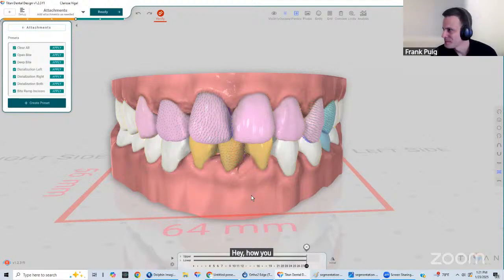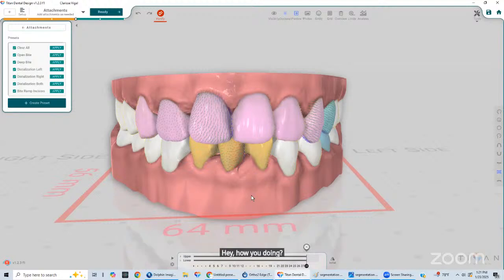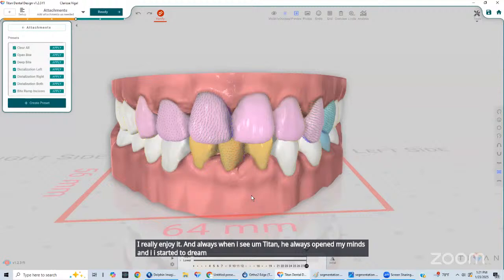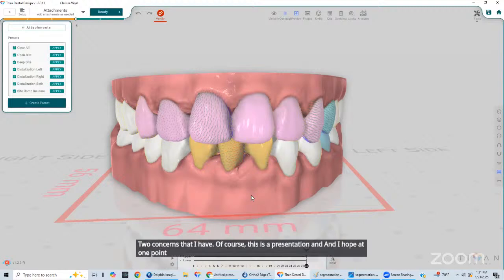How you doing? Mario, thanks for your presentation. Thank you. I really enjoy it, and always when I see Titan, it always opens my mind, and I start to dream. And a couple things. Your presentation was outstanding. The case selection was really good. It's an easy but difficult case. Two concerns that I have. Of course, this is a presentation, and I hope at one point we don't spend that much time doing treatment plan.